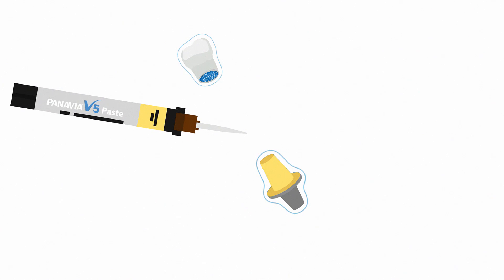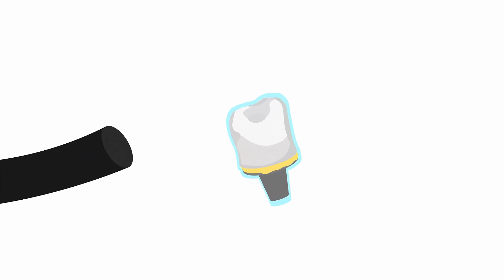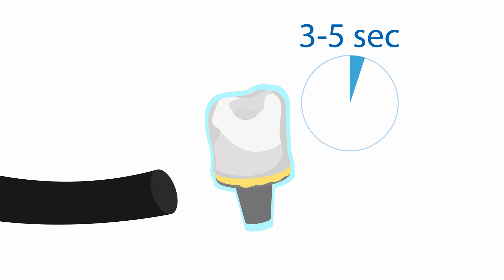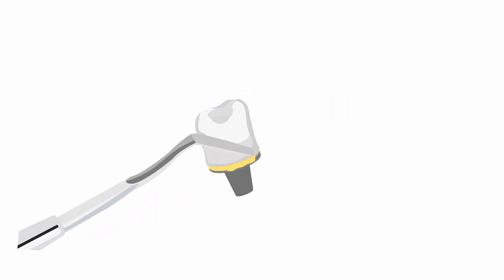Dispense the cement to the base and the abutment. Thanks to the optimized cement consistency, you can position your prosthetic exactly. Light cure for 3-5 seconds for an easy removal of excess cement, and the excess cement is cleaned up in seconds.